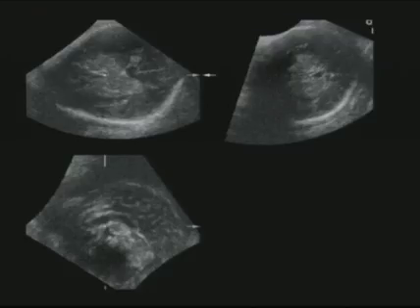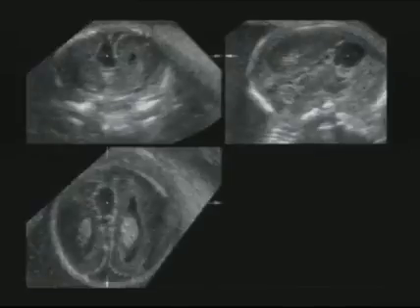How is that useful? Well, it is incredibly useful because in this third trimester fetus, whose head was way down, I wanted to image the corpus callosum. But there was no way in either of the two planes that I could scan in that I could display the corpus callosum. So I took a sweep right here and reconstructed the midline to show the corpus callosum. So I can reconstruct this view because it is in the volume. And all I have to do is figure out how to display the one view that I need within one whole volume.